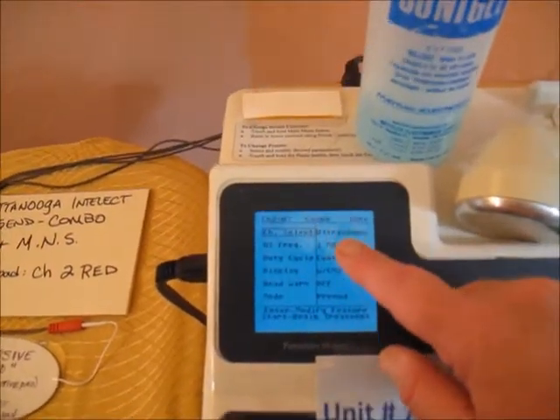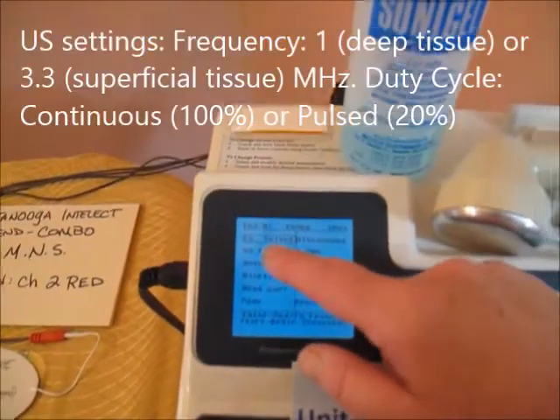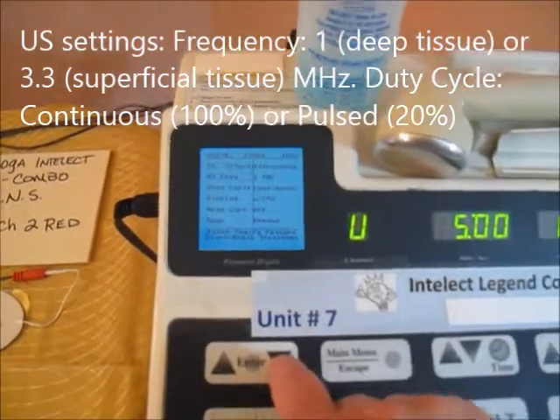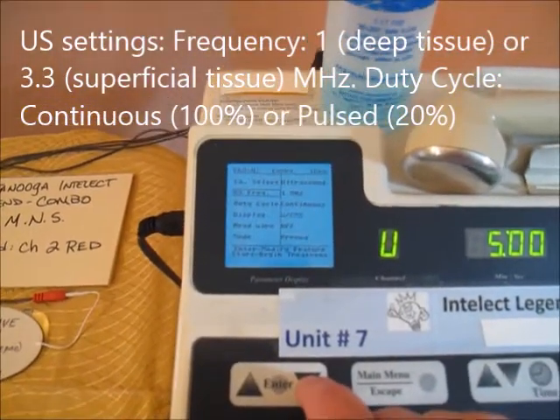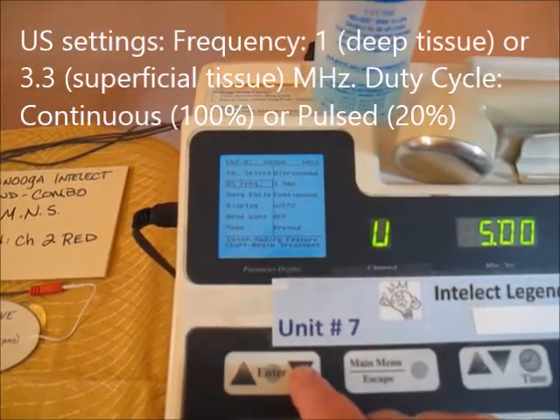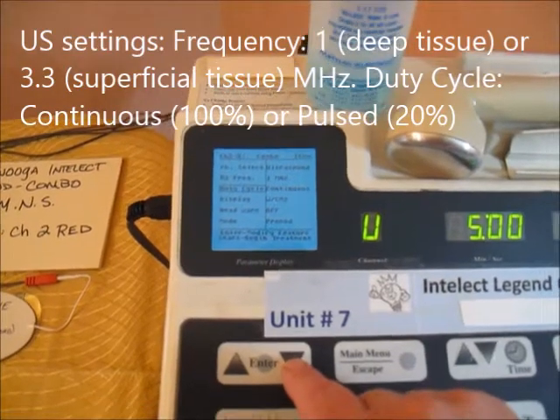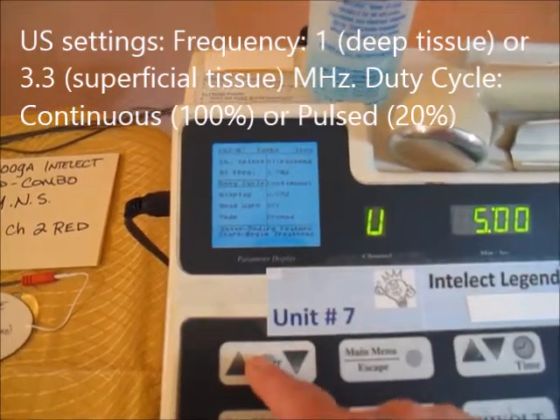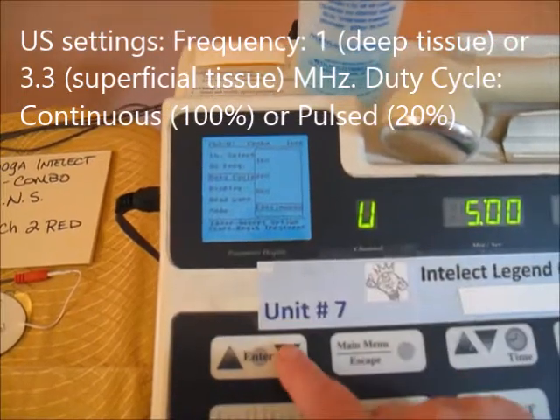First, set your ultrasound settings. Set your frequency to 1 megahertz for deep tissue, or 3.3 megahertz for superficial tissue. Set duty cycle to continuous for heat, or hit select to change it to 20% for pulsed.